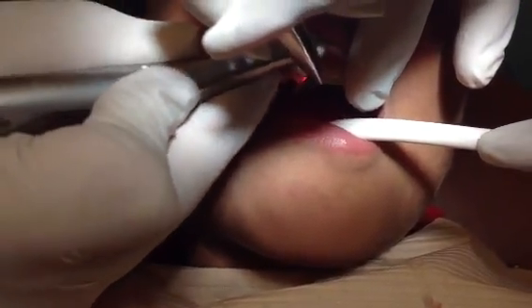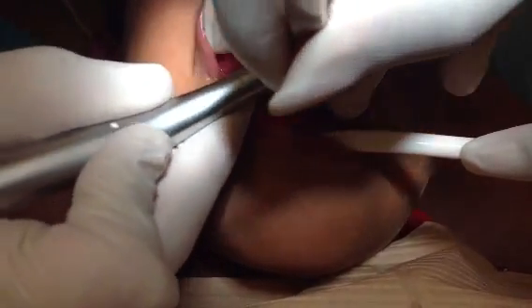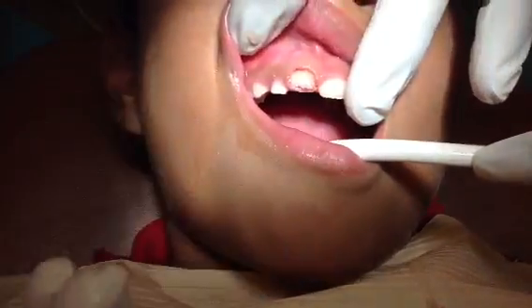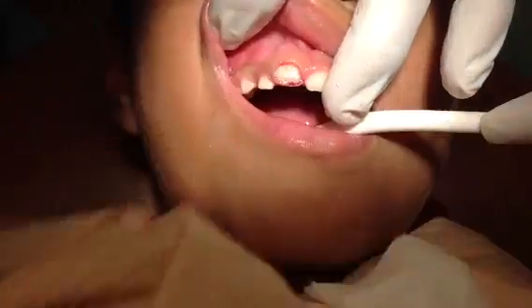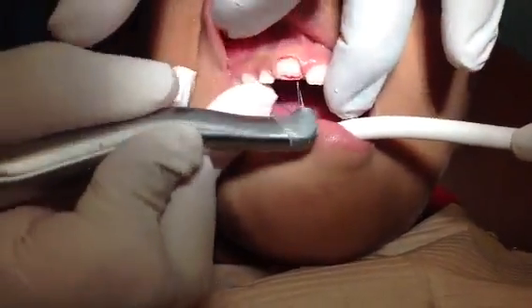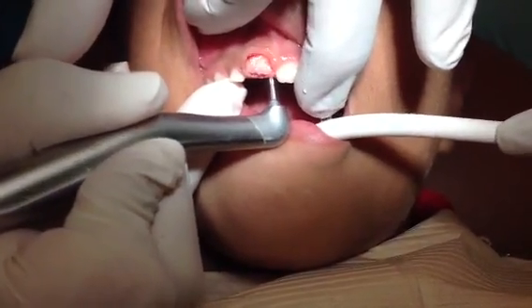And as you can see, the laser cleared away the tissue. No bleeding. Keep filming. We're going to do the lingual now. Look up to the sky, please.